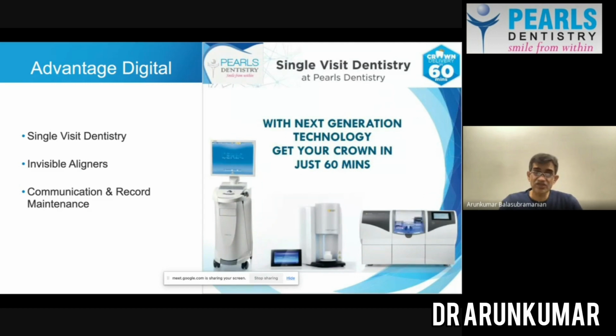The next important aspect is called single visit dentistry, and in single visit dentistry, the typical time frame is when we go to a dentist to get a crown done or to get a veneer done. It's usually a two-sitting process where it takes approximately a week's time, where the dentist makes a measurement and then sends the measurement to the lab. The lab gets it back.